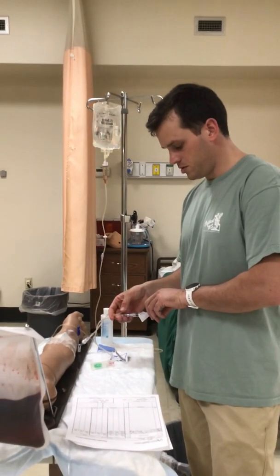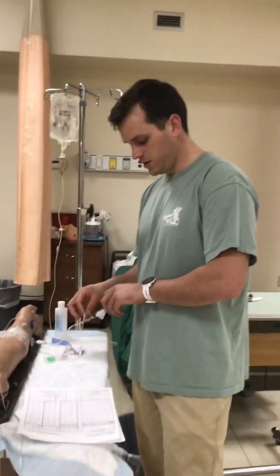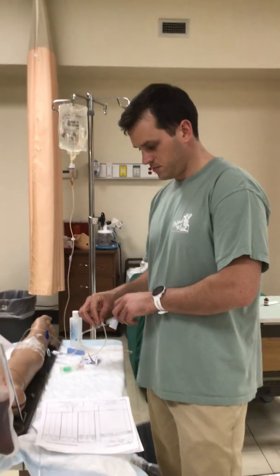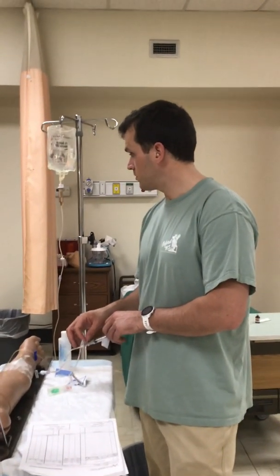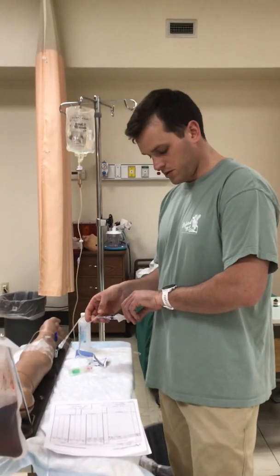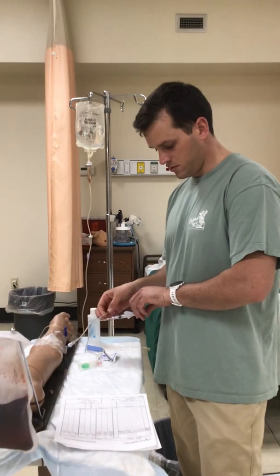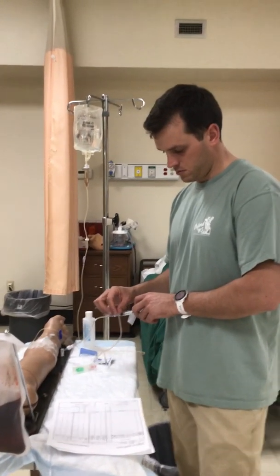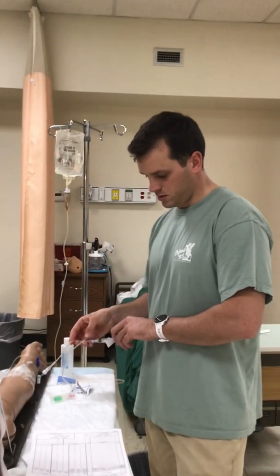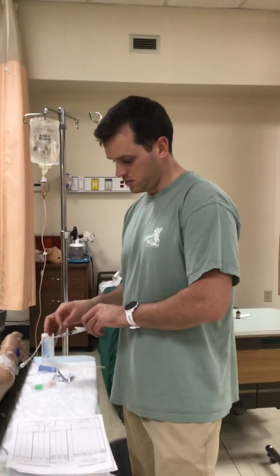Pinch, administer, release. Pinch, administer, release. Pinch, administer, release.